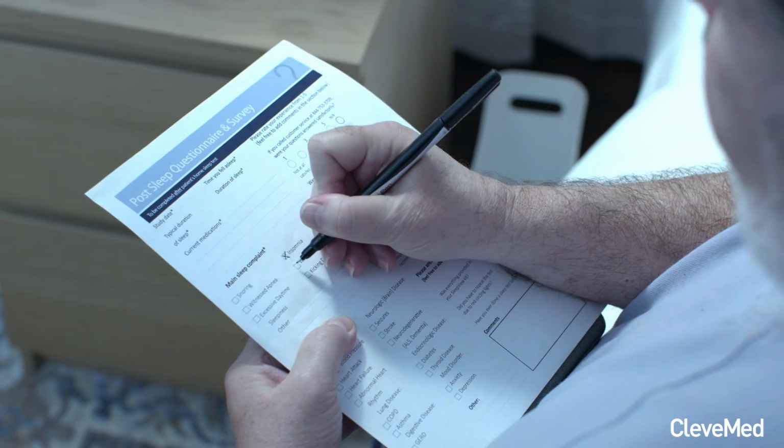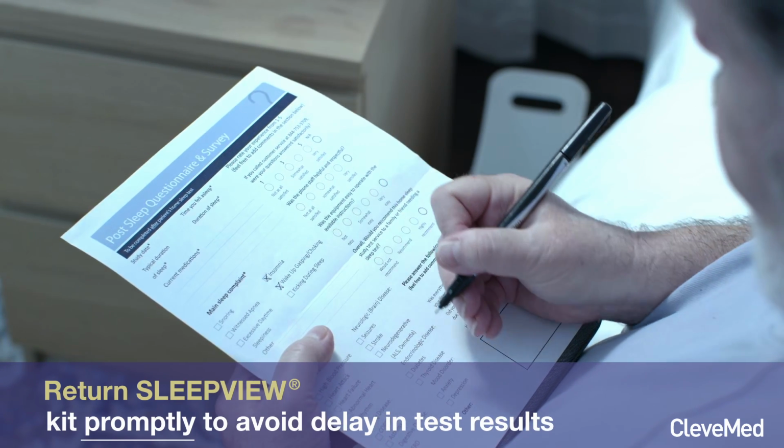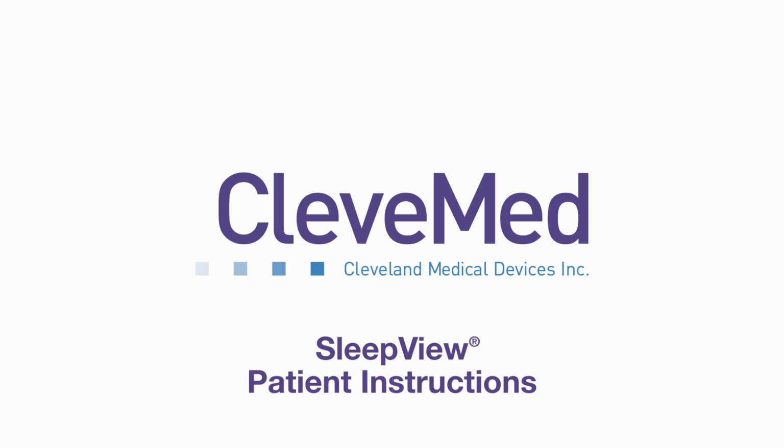Fill out any paperwork that may have come with the kit. Return the test kit right away to avoid delays of your test results. We hope this video helped you complete your home sleep test with the SleepView Monitor.